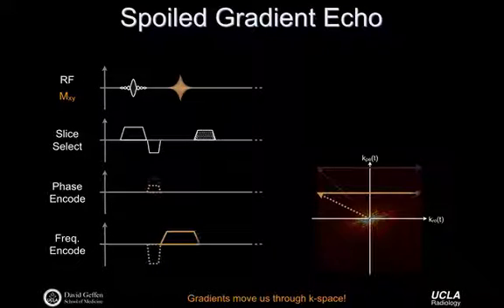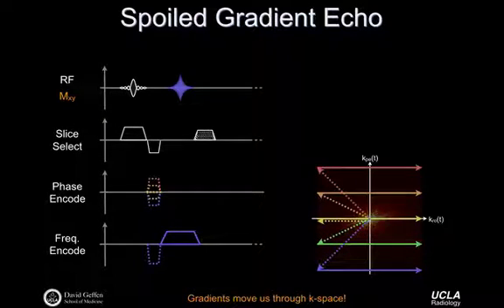And the whole imaging experiment, again, is about reading out data generally along what we call the readout direction, or the frequency encoding direction, and in this case, we get another line of echo data to slot into our matrix of information we're trying to acquire to build up everything. And the whole imaging process just repeats itself many, many times. So in this case, what's really changing is the phase encoding gradient, right? We're cycling through five examples of the phase encoding gradient. The middle example is right here, meaning it's really not turned on. And that means it's just the frequency encoding that's moving us through k-space. So for this yellow line here, we're really just moving to the left and then moving back left to right.